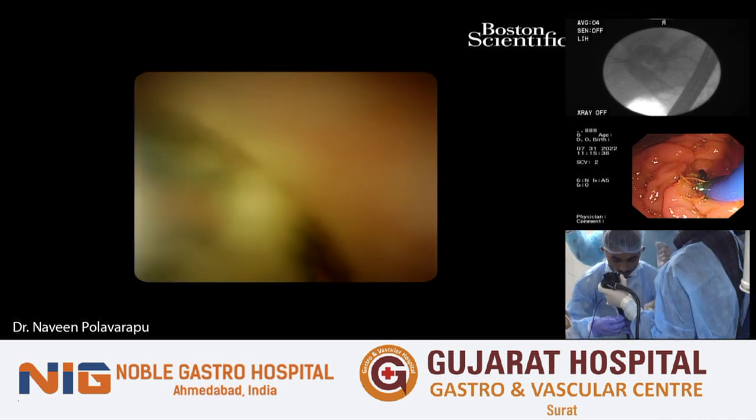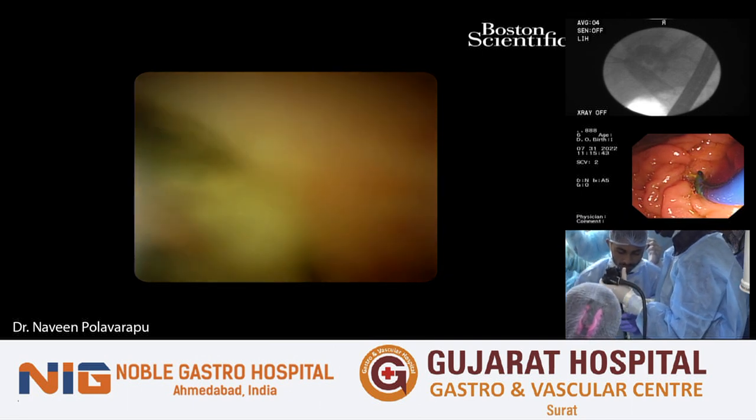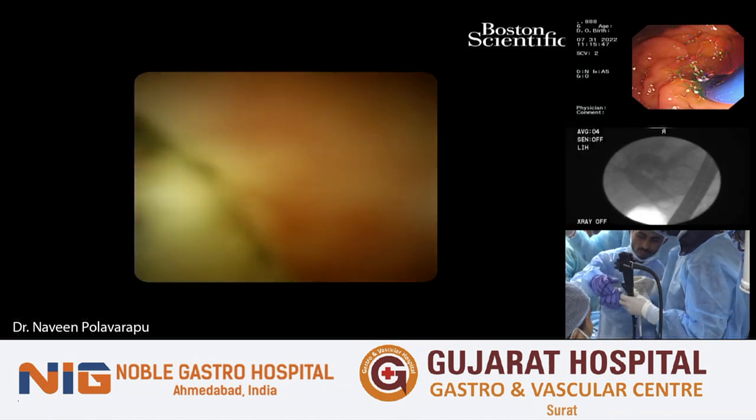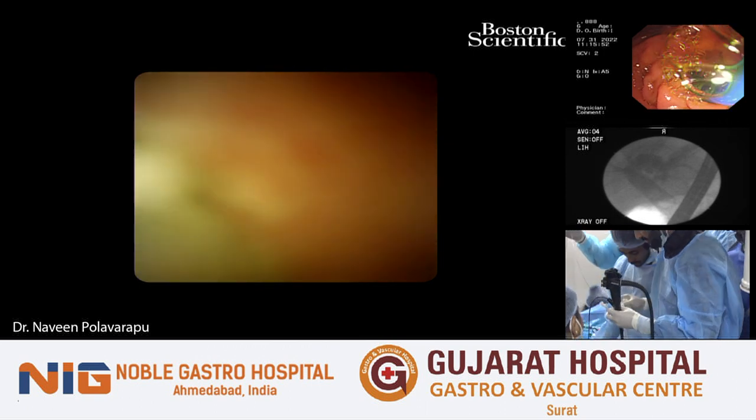Stone is right there in front of you. Yep, absolutely. We can see the stone already there. Brilliant. Locked it. Brilliant. Okay, so flush please. I'll put the wire in.